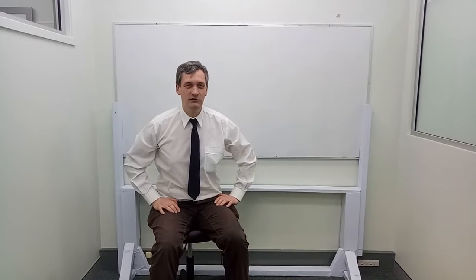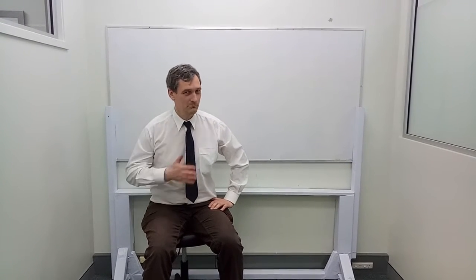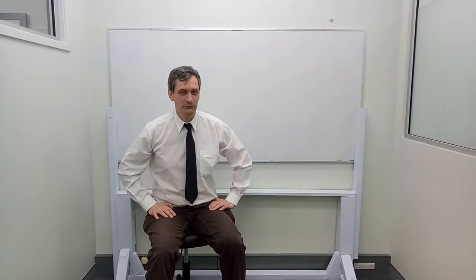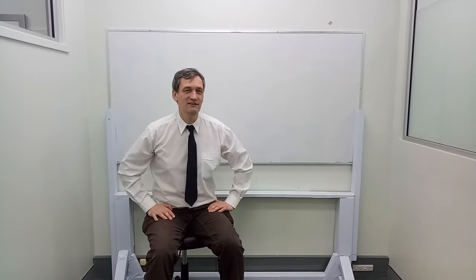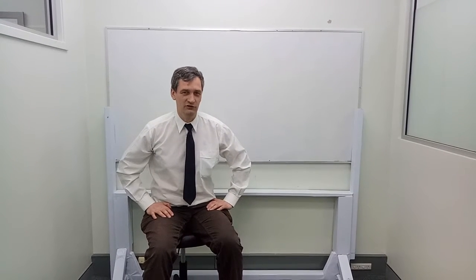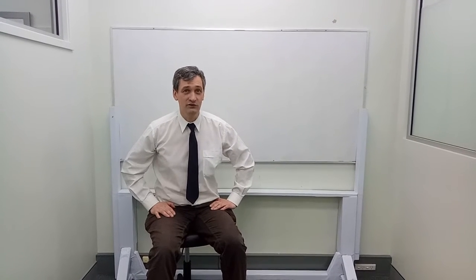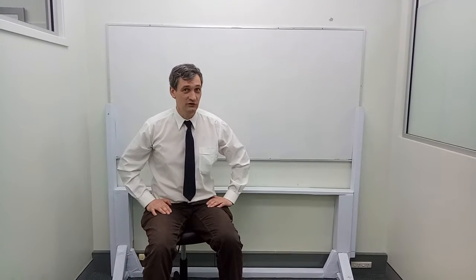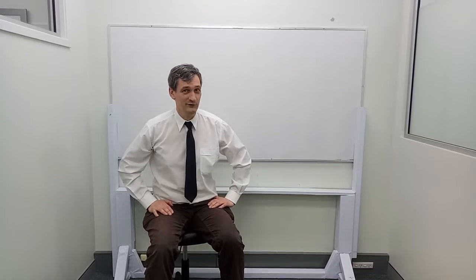We've been receiving some questions about what splint position we should use. My name's Jason Fairclough and I'm one of the innovators of the technique, and I hope to answer this question today. So the first thing to say is it depends on the type of fracture that you're dealing with. If you have a non-displaced fracture, regardless of whether it's simple or comminuted, you may find that the best position to use is a POSI splint, and we're just going to demonstrate that for you now.